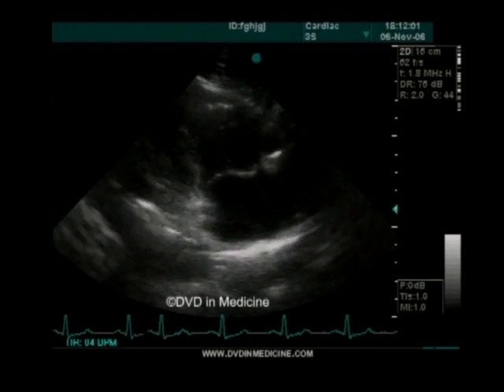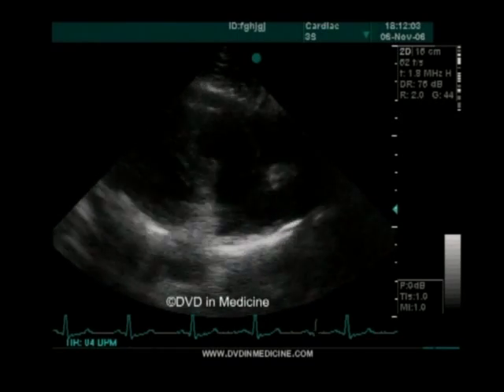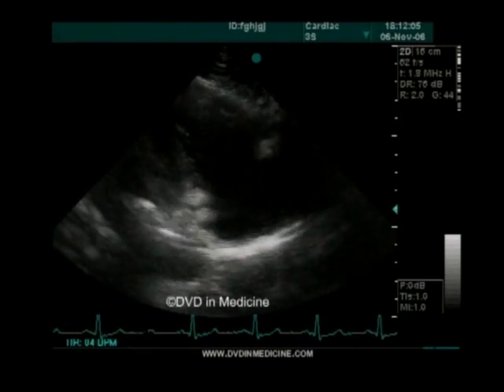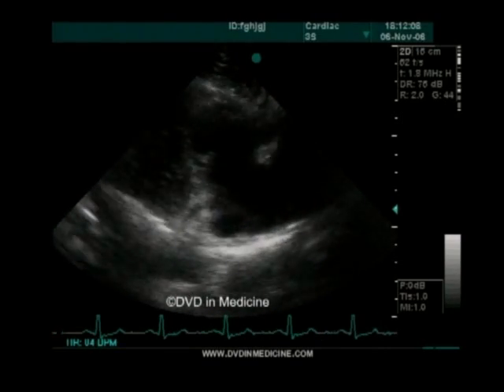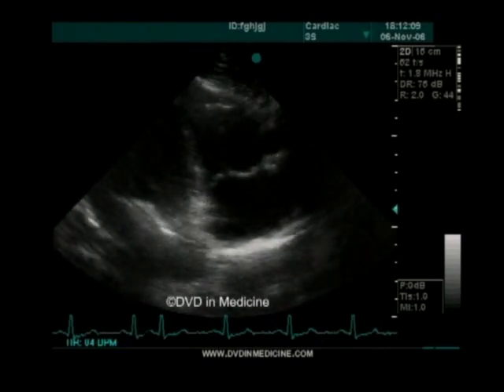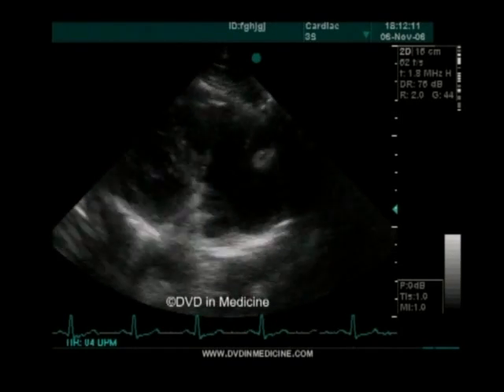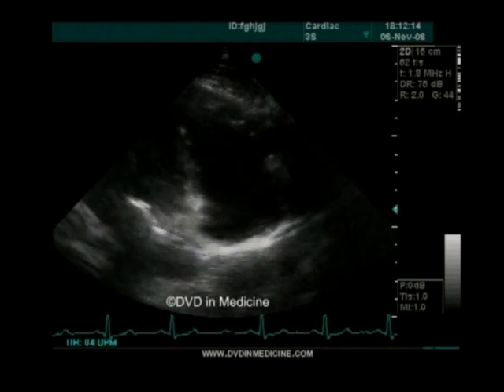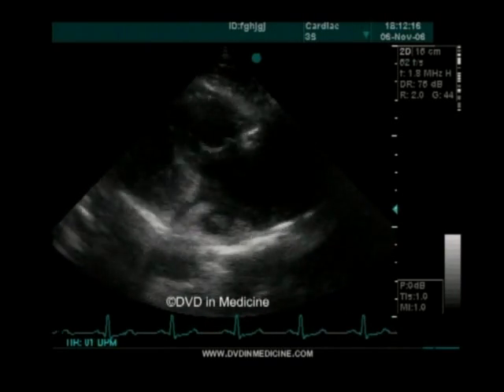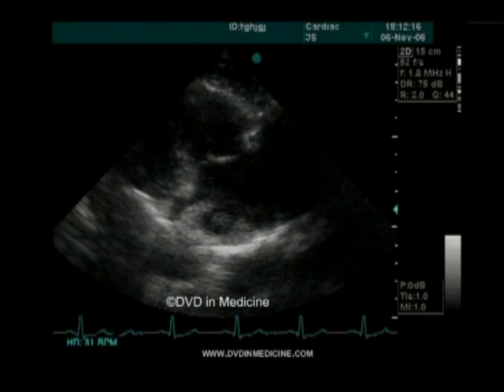In the case of tricuspid stenosis, the leaflets dome in diastole like a parachute. Doming is one of the main two-dimensional features of any stenotic valve. In this image, one can see the spot where the coronary sinus empties into the right atrium. This is the diaphragmatic surface of the heart between the right ventricle and the right atrium.